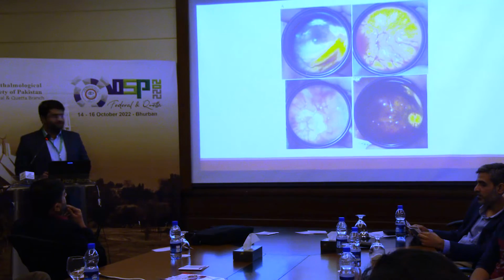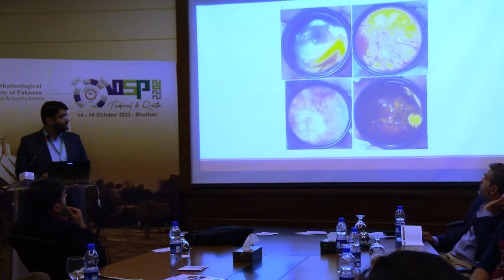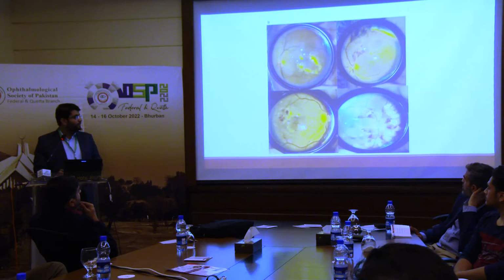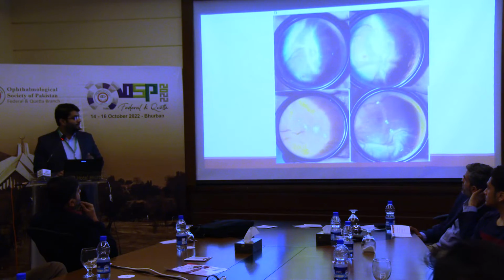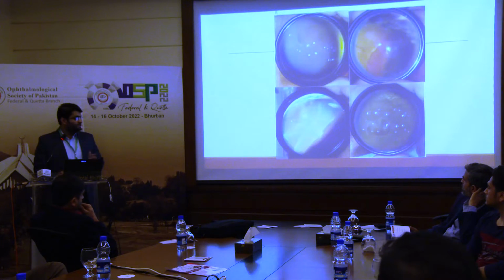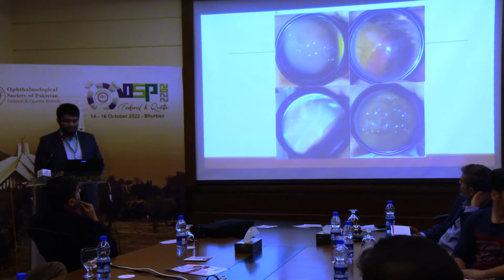These are a few pictures taken by me showing different anomalies of the retina: myelinated nerve fiber layers, myopic fundus and ocular albinism, macular edema, and retinal detachment in different gazes showing the macula and peripheral retina, also different retinal breaks, GRTs, and U-shaped retinal tears.